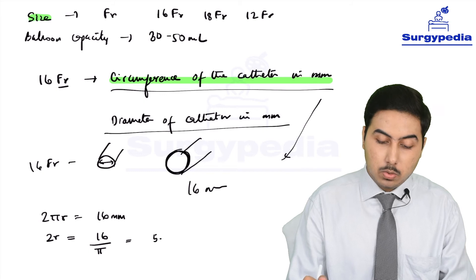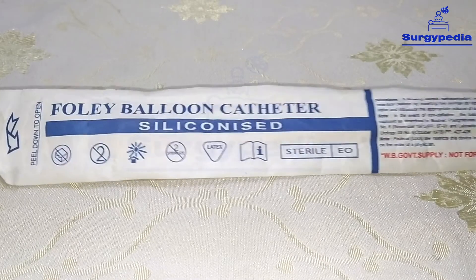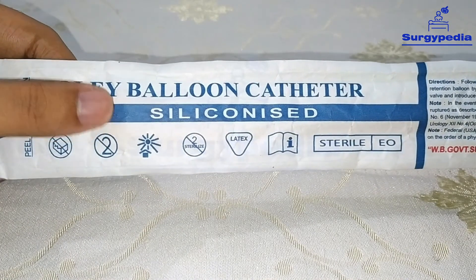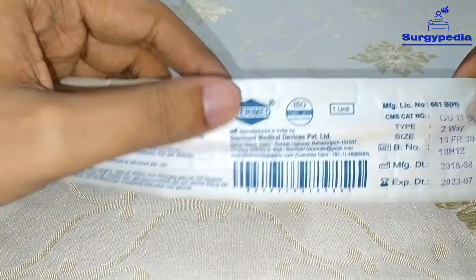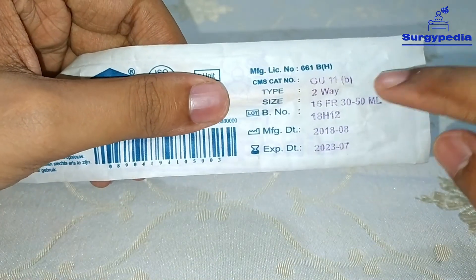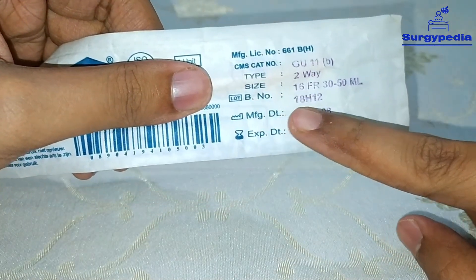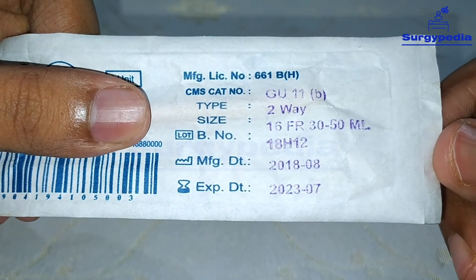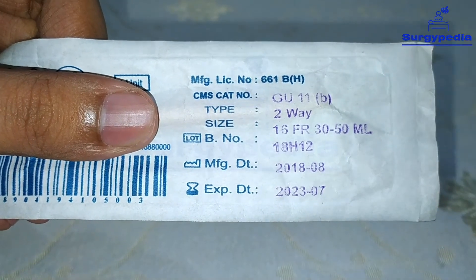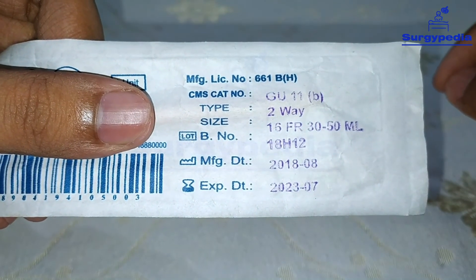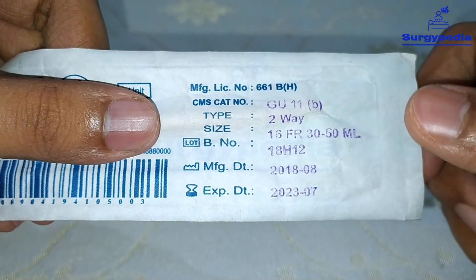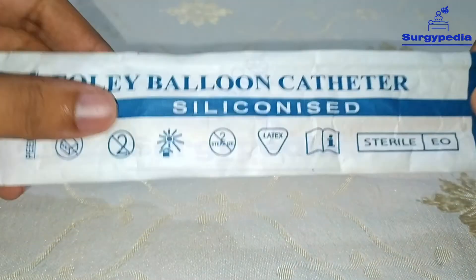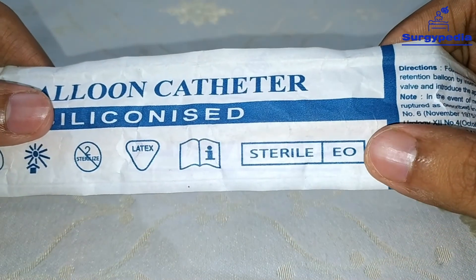Now let's have a closer look at the Foley's catheter. This is a Foley balloon catheter — siliconized — as written on the pack. The main part of the pack shows the size, which is 16 French, written as 16 FR. And as we discussed, 30 to 50 ml is the balloon capacity. Manufacturing date and date of expiry are also marked.